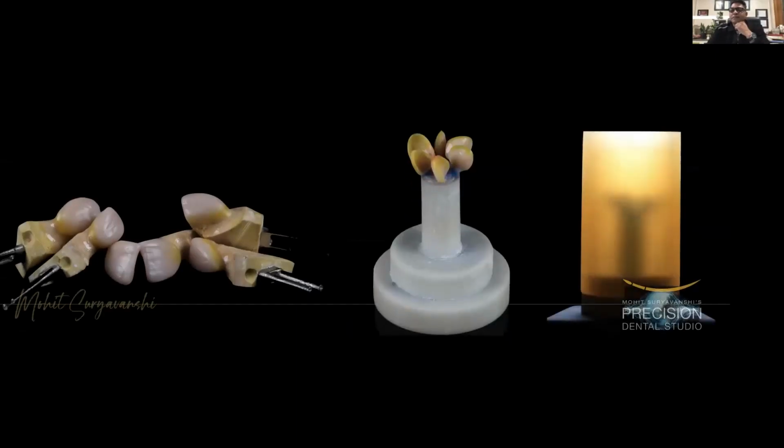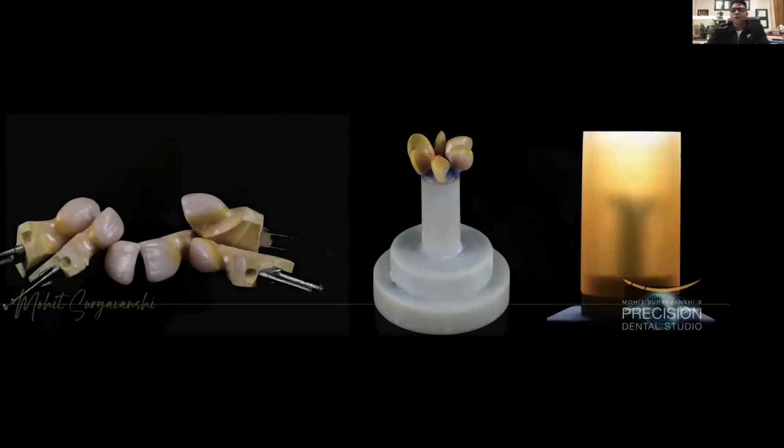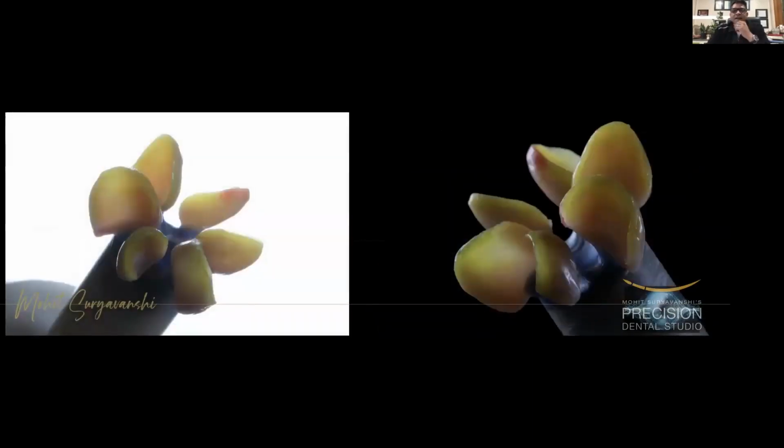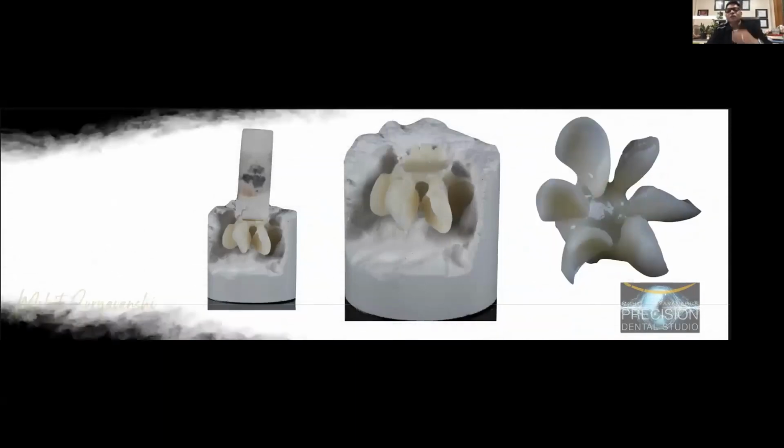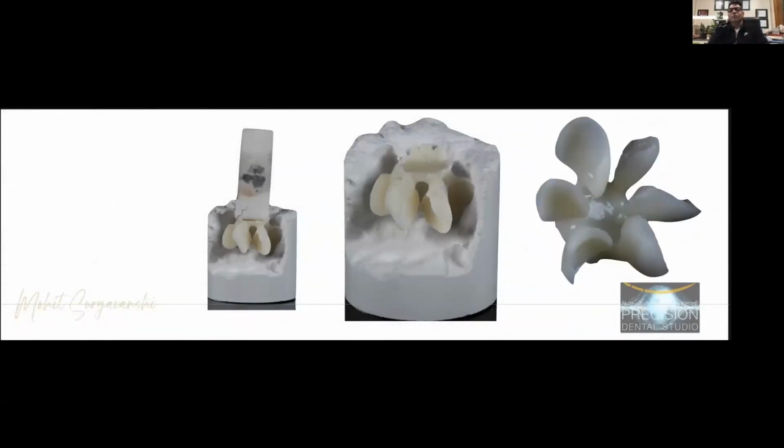We're going to press them. As I said once again, the investing and the powder liquid ratio protocols also matter a lot. You need to understand when it's a veneer, when it's a crown, when it's a bridge, when it's an onlay, the expansion, liquid and powder ratios differ. We get the right kind of result. You can see how much output we have achieved from the ingot. So that's how reliably we can achieve it.